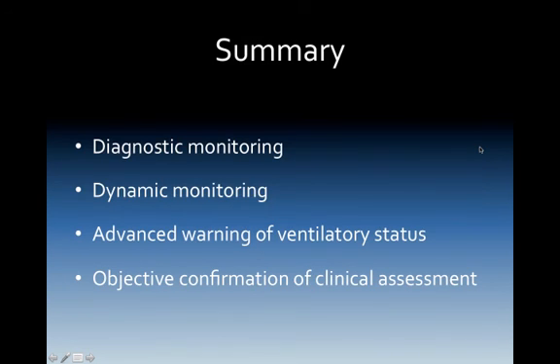So, in summary, the end-tidal CO2 can give us instantaneous, minute-to-minute, second-to-second diagnostic monitoring, and it's dynamic monitoring. It gives us advanced warning of ventilatory status compromise, and it gives us objective confirmation of clinical assessment. So I think this person may be in respiratory acidosis. Their end-tidal CO2 is very, very high. The machine agrees with me. So please utilize all your tools.